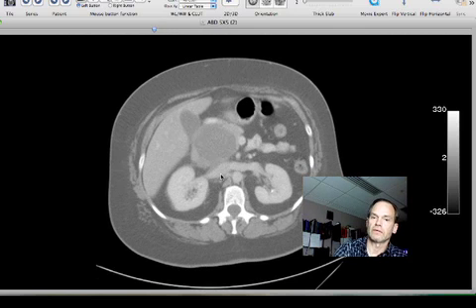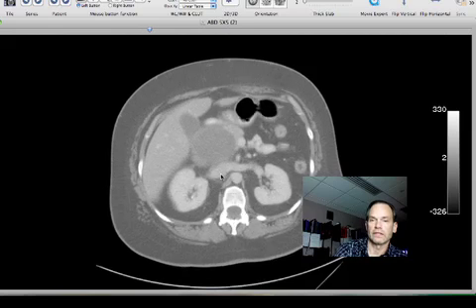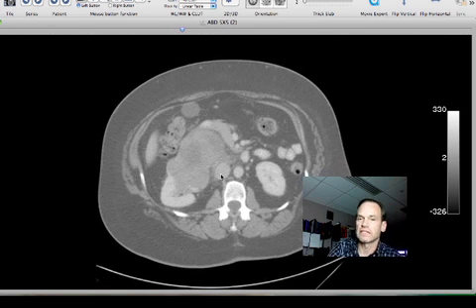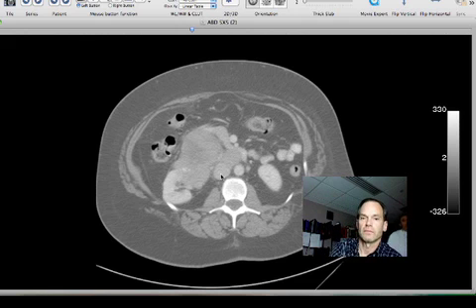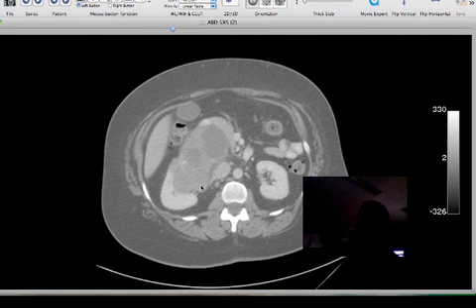So it is that type of anatomic relationship that really determines whether something is arterial or venous. So always look for that rather than simply their size or what they look like. You want to make sure you know what a vessel is connecting to before you give it a name. Now around this mass you also have a fair amount of stranding, which is inflammatory probably, or maybe some infiltration by the mass. This is important because this is how tumor may extend.